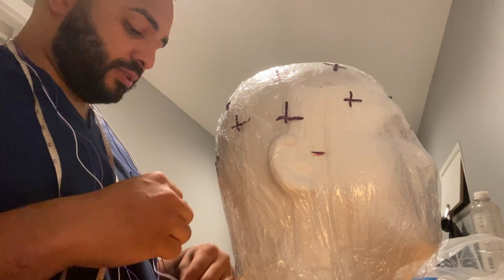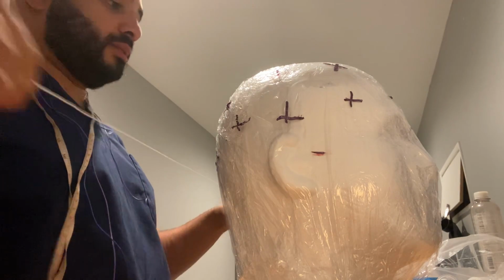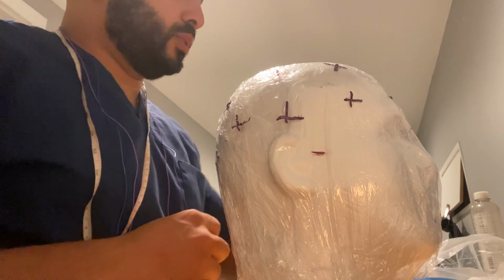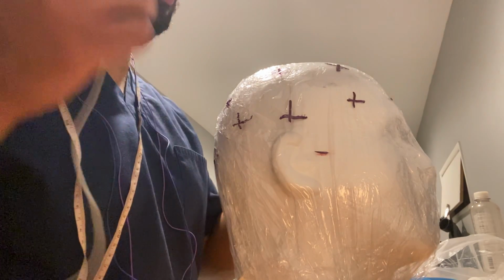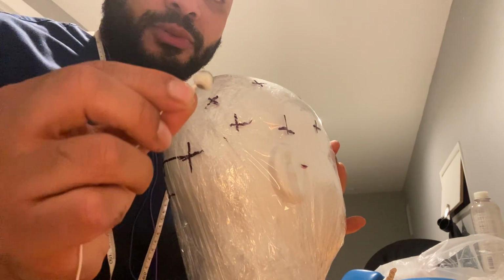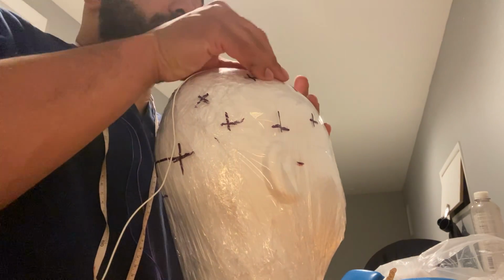Now I'm going to take my first electrode. I'm going to dip it in the 10-20 conductive paste, which will increase the conduction of the brain waves to the electrodes. I'm going to take a scoop of ice cream, one scoop, place it here on my FZ.